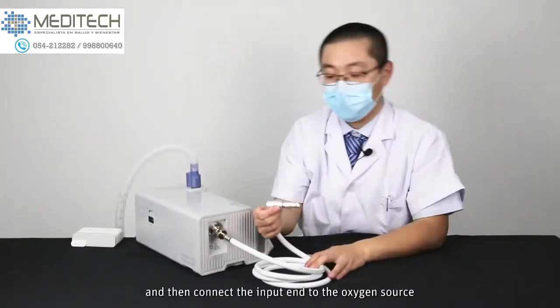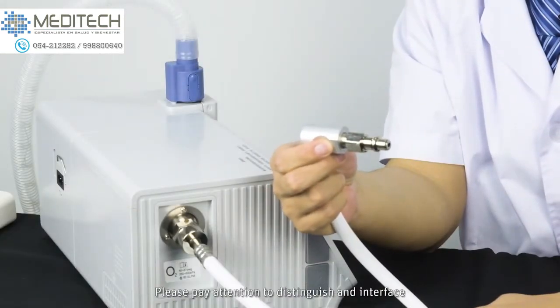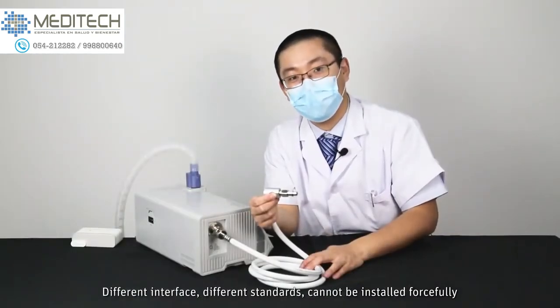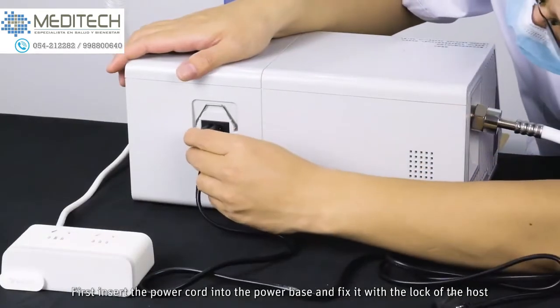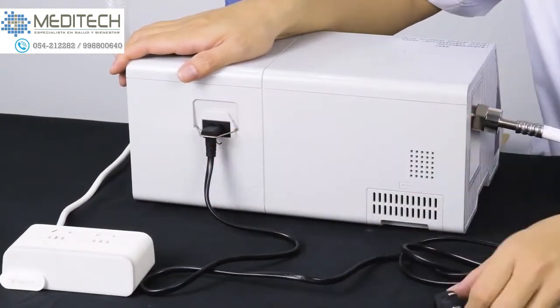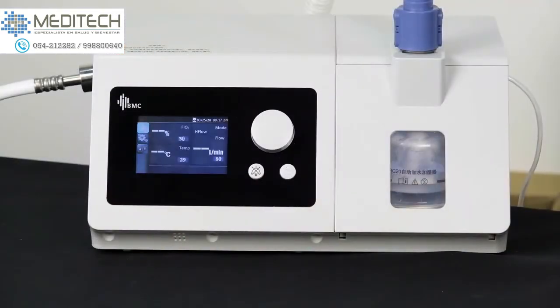frame connection, and then connect the input end to the oxygen source. Please pay attention to distinguish the interface. Different interface, different standards cannot be installed forcefully. First, insert the power cord into the power base and fix it with the lock of the host. Power on the machine and the screen lights up.